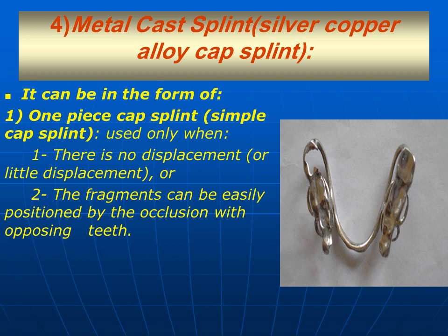At the time of placement I can give anesthesia and do closed reduction of the fracture segments to the proper relation and place the splint.